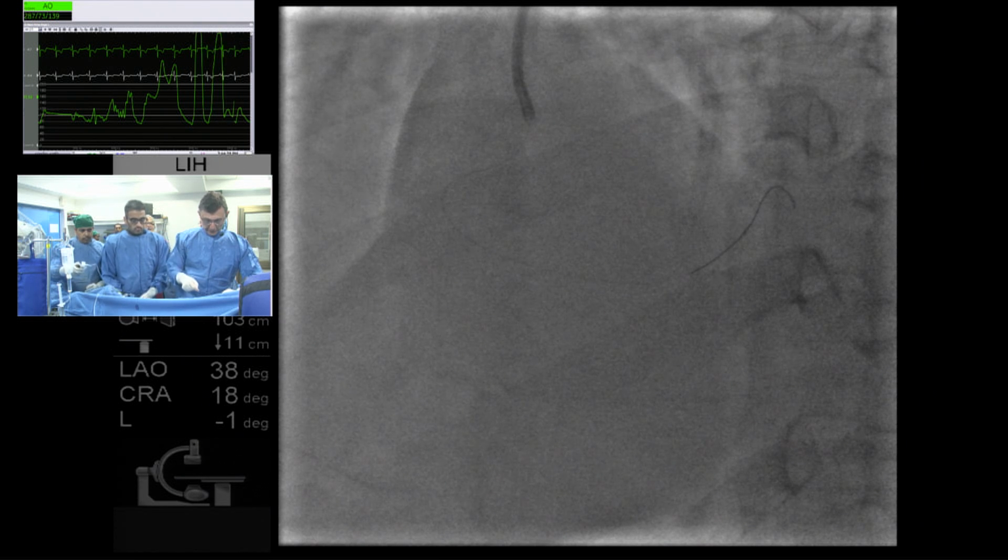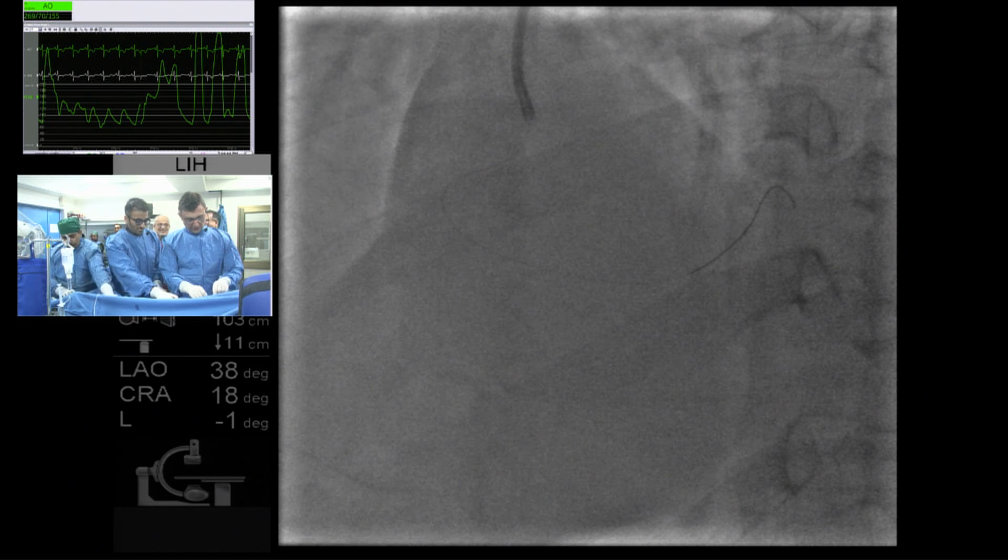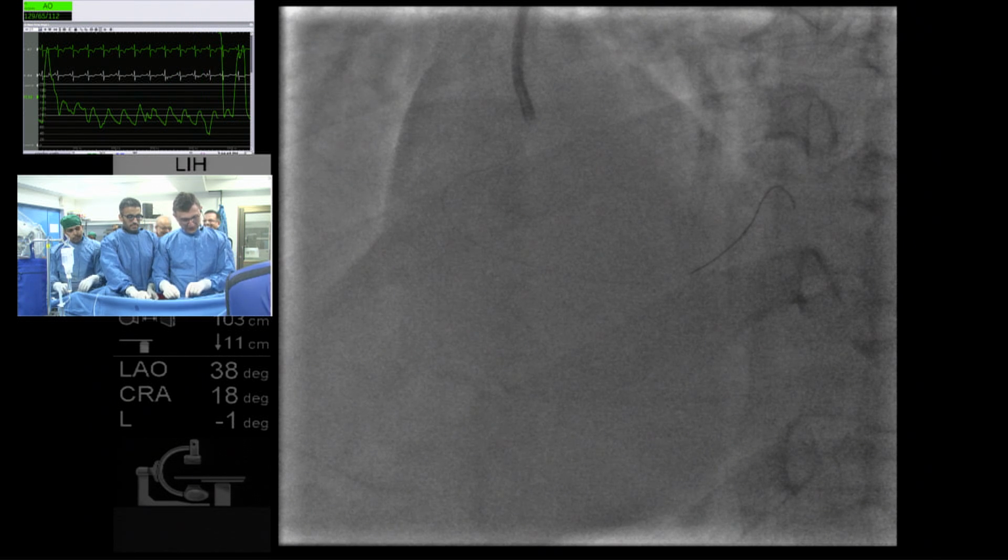So we settled on the length of 48. Mauricio, this is India. The stent has legs. It has already walked in. 3 by 48. 3 by 48. That sounds good. It might be deployed.